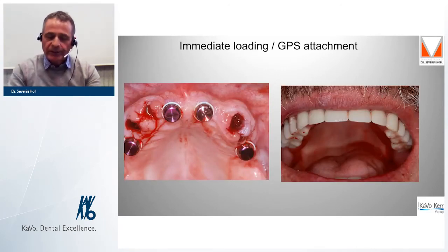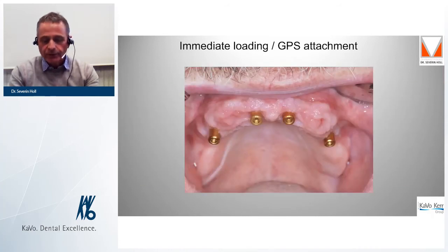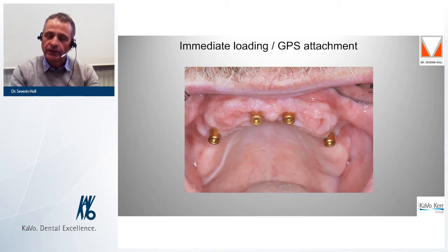We start with the prosthetic work steps and fix the female elements on the GPS abutments. Polymerize them into the prepared interim denture. Thus, the patient leaves our clinic with a stable, fixed, temporary denture. Already, after 4 weeks, you see a well-healing gingiva. After the healing, we provide the patient with a metal-reinforced palatal-free implant denture, either on GPS or on bar attachments.